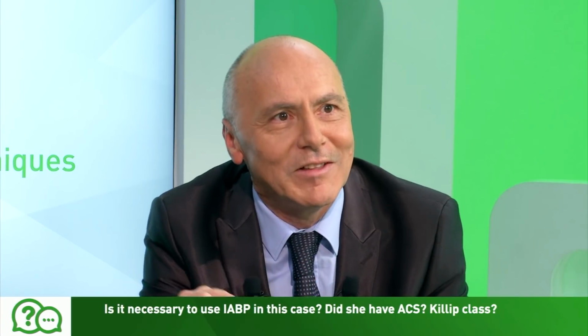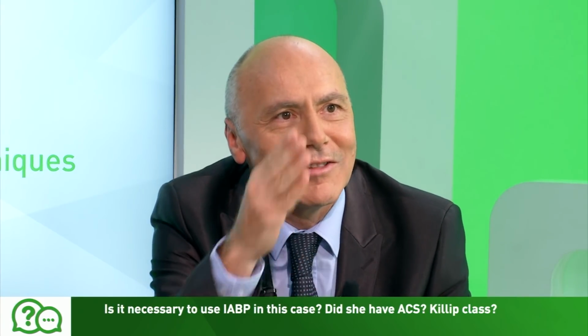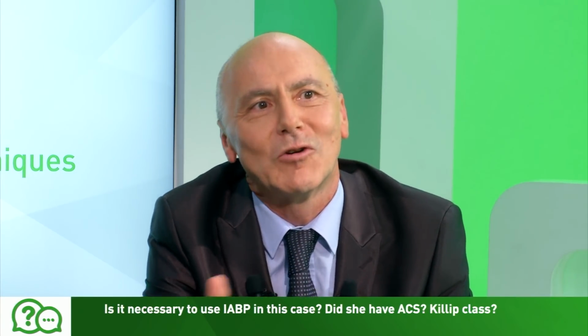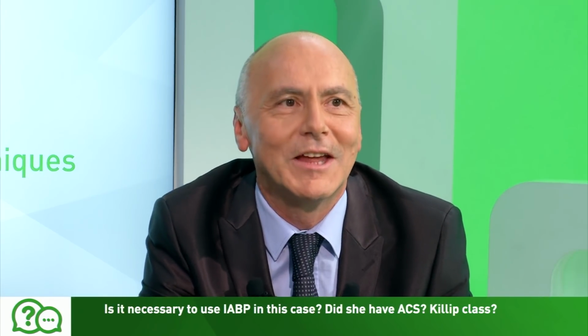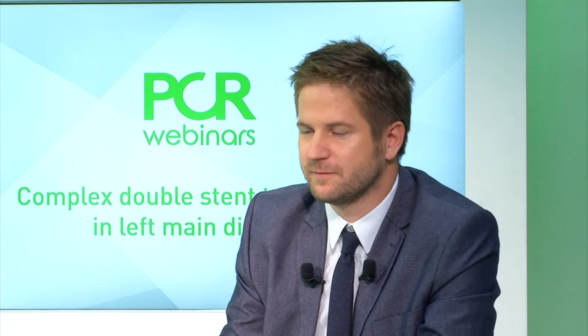So it's more like a pressure device than a flow device. When you see that tight lesion, when you increase the diastolic pressure and thereby coronary perfusion pressure, when the autoregulation is already exhausted, you may at least maintain, in theory, coronary blood flow. So we can agree this patient did not have much reserve, so you wanted to stay on the safe side.